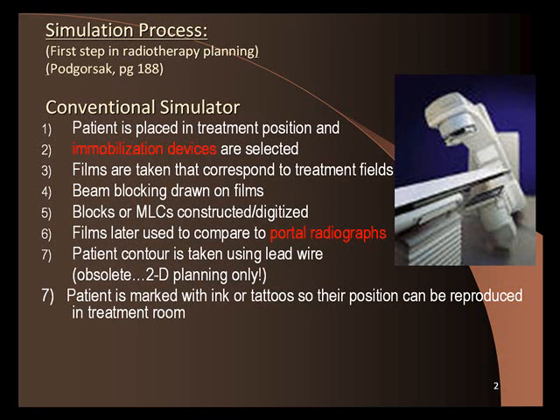the isocenter, bing, they take a picture. Okay, they take a radiograph of that. And for that radiograph, we put a film in this cassette holder. Okay, have you guys seen cassettes? What a cassette looks like? It's a flat rectangular piece. You can open it up, and you put a piece of film inside, and you lock it shut.